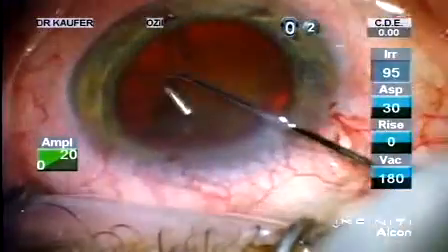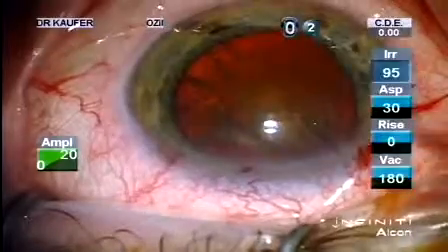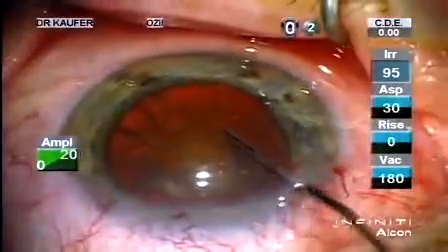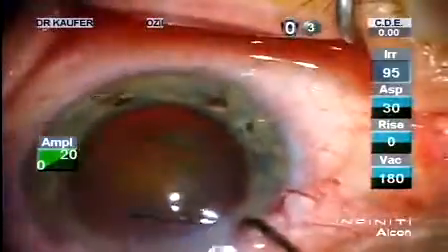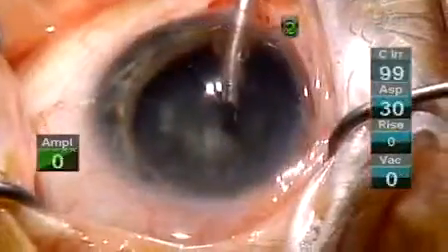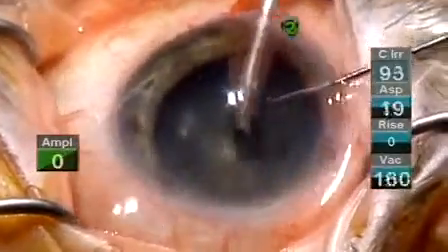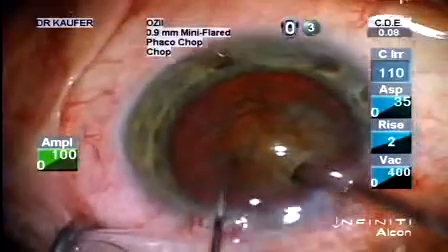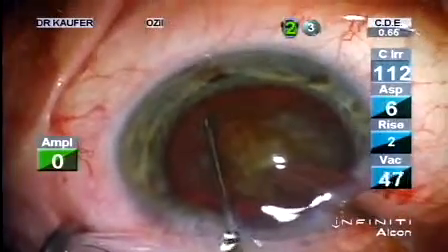This is a very hard nucleus, so we will try and divide it into as many pieces as possible before emulsifying it. It's very important, especially with this kind of nucleus, to free it in the capsular bag, to get it loose. Since this is a very hard nucleus, I will use a very sharp chopper in order to produce the first quadrants. That is a milky substance that you see due to the ultrasound, to the Ozil.